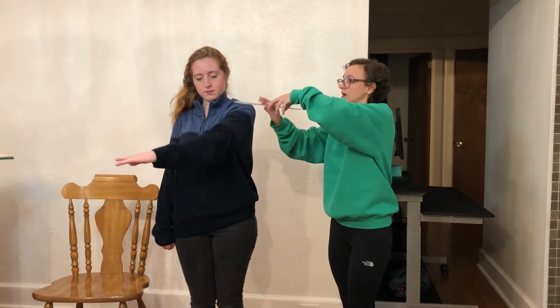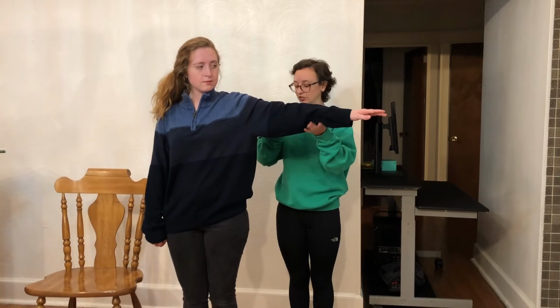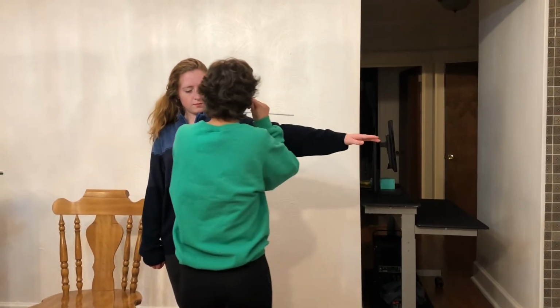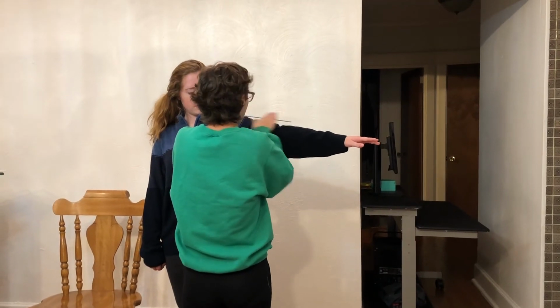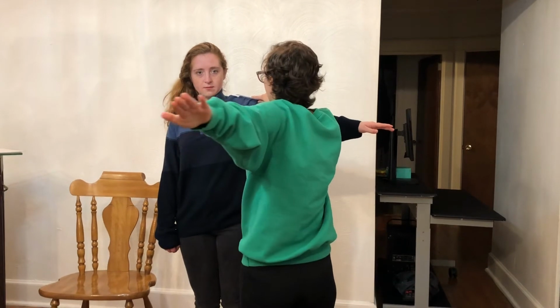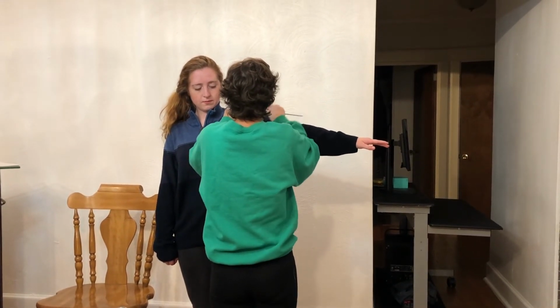Now, similar starting position for horizontal abduction. I'm going to have my patient with her arm out here. I'm going to stand in front of her so I'm not in the way of her arm. Fulcrum up on the tip of the shoulder, stationary arm in line with the body. For this one, I'm going to have you reach backward, keeping your arm at the same level. Go ahead whenever you're ready.